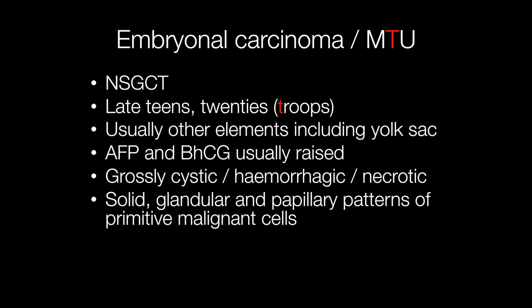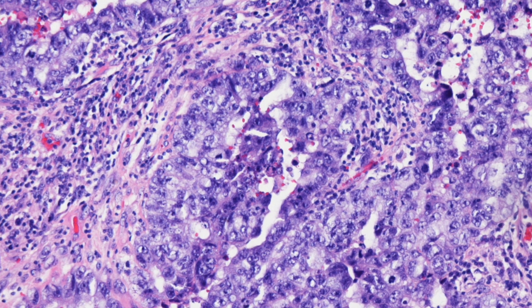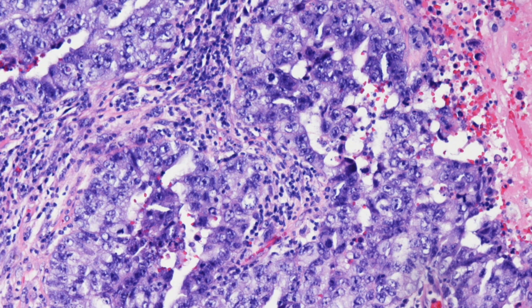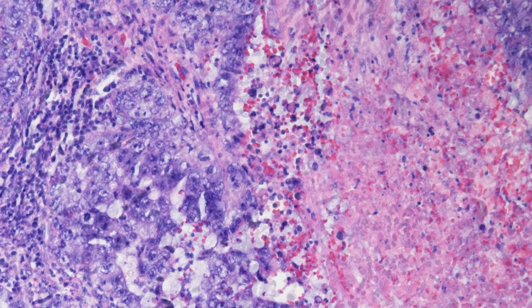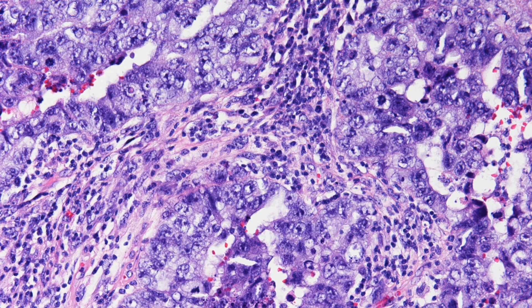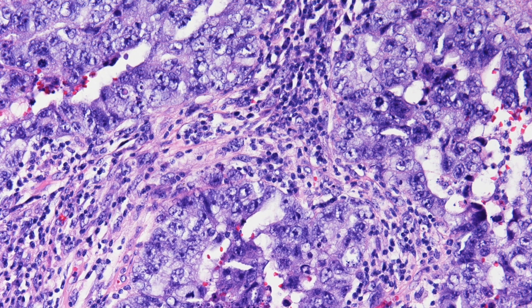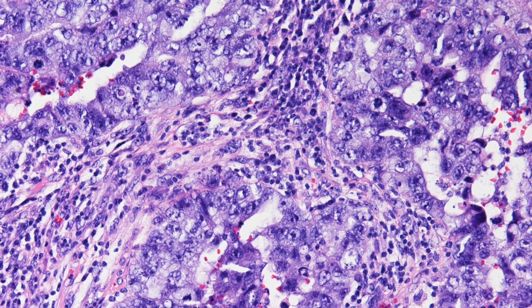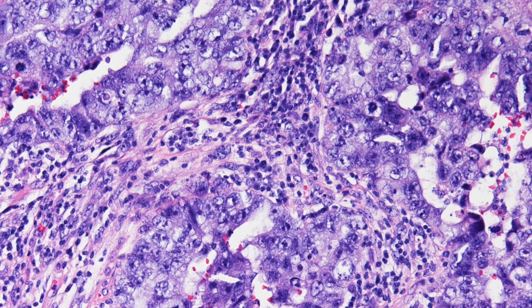The tumours have a grossly cystic, hemorrhagic, and necrotic appearance. Histologically there are solid, glandular, and papillary patterns and the cells have a primitive malignant appearance. Here you can see malignant primitive cells forming glandular structures; as we move towards the top right of the picture, the pink area is an area of necrosis. At higher power you can appreciate the pleomorphic appearance of the malignant cells. This case is slightly unusual in that the patient was 49, which is rather older than the usual age at which these tumours occur.